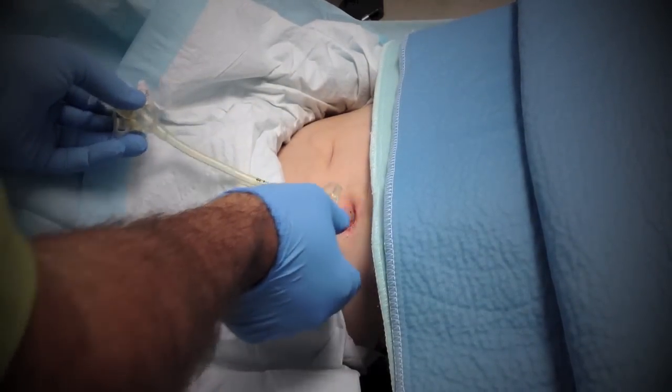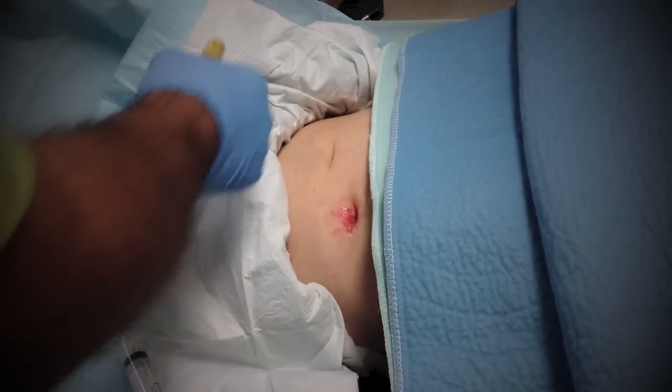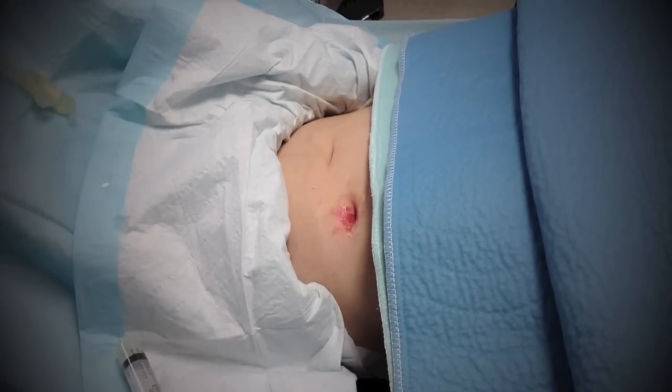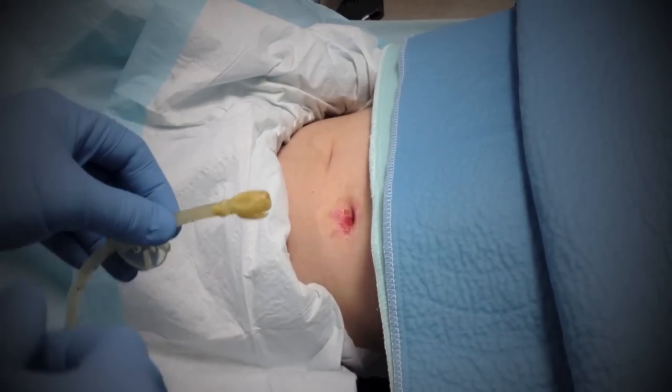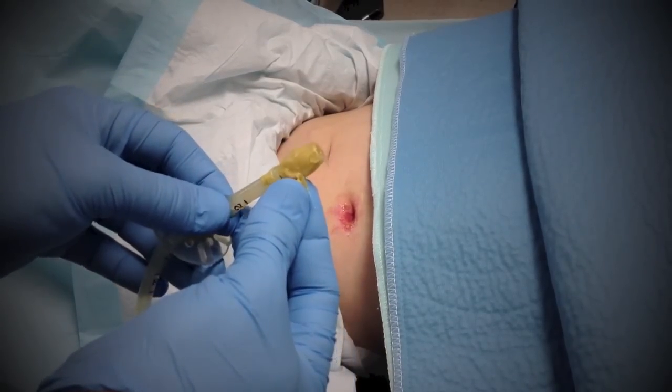You can look at Nikki's replacement on the website. It's a little sticky. And see, the balloon is actually torn right here — this is why it malfunctioned. The balloon actually broke right there.